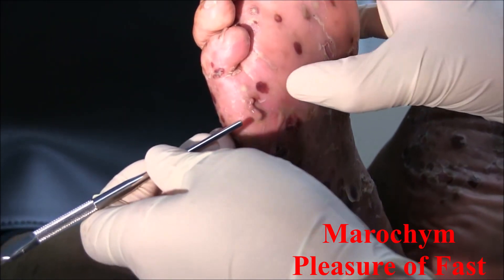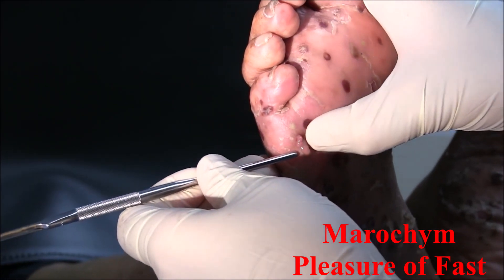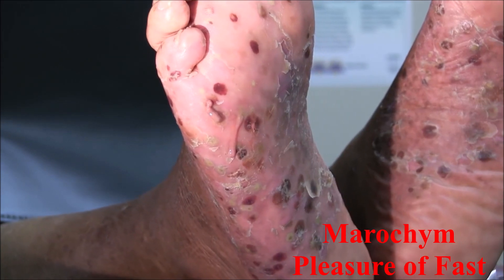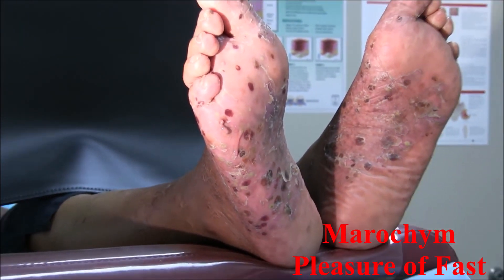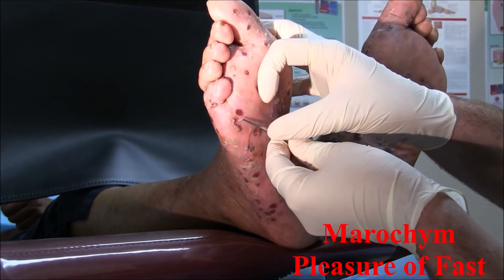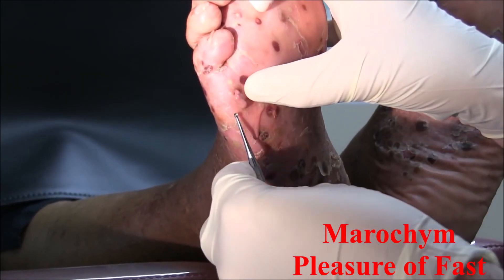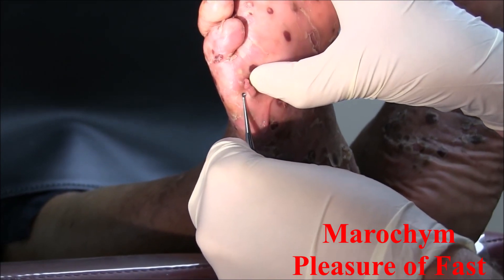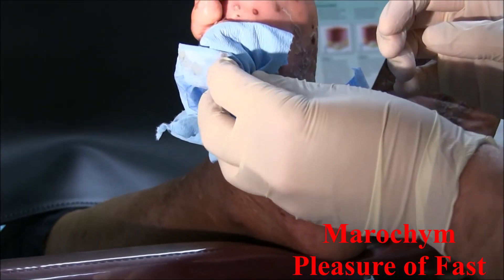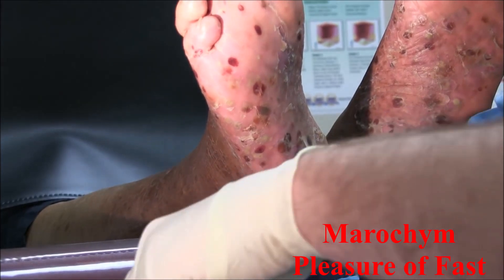I'd like to see if I can get a little bit of that material. What I'm going to try to do is take a little bit out. Because what I'm doing — if you've got an infection like the patient's got — I'm trying to get it to where it drains out. Look at all these small little pustular lesions I'm trying to get removed.